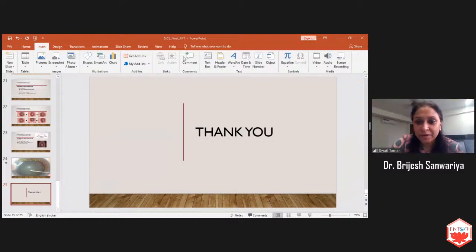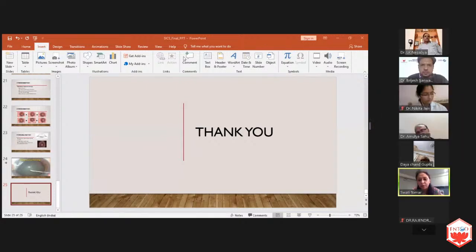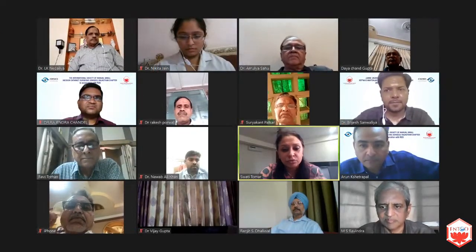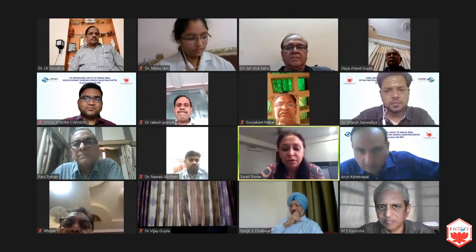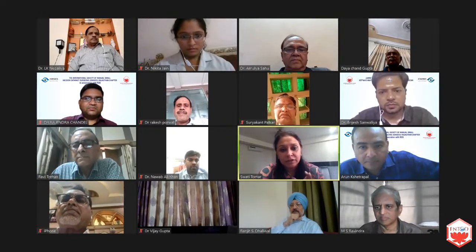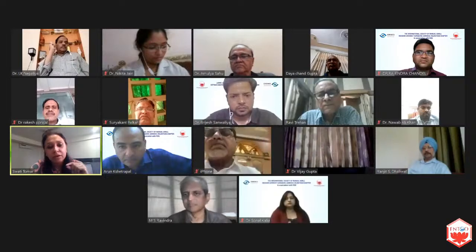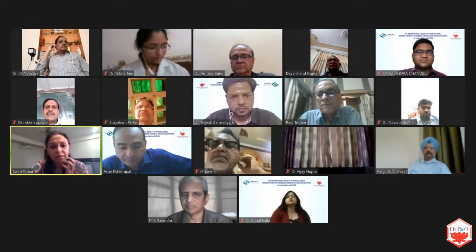I think Brijesh presented really well, and a very important step of making a rhexis is how you move your needle or your forceps. Anytime that we feel, especially for beginners and for everybody, that the rhexis is going to go out or is going to be a little bigger than what we desire, you start pulling it centripetally and change from the needle to a forceps if you are accustomed to doing it with a needle. And anytime that you feel it is too small, then you can take it a little more forwards and, with the help of the rhexis forceps again, make it a little bigger.